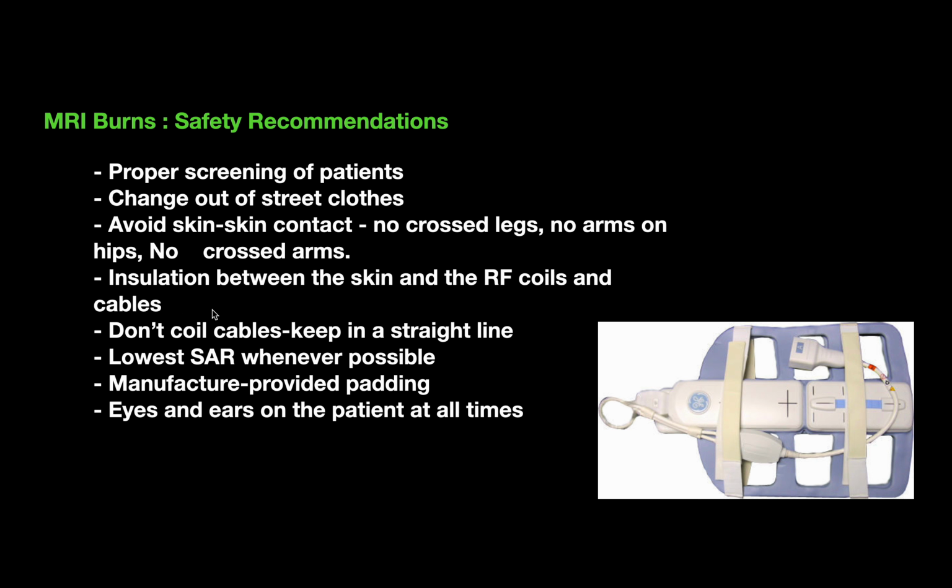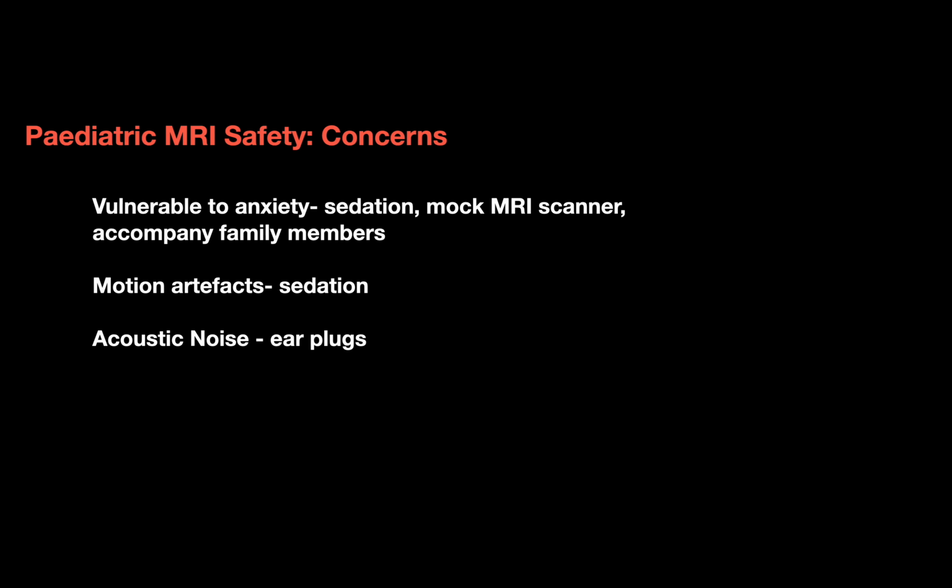Insulation between the skin and the radio frequency coil and cable should be there. Don't coil the cables. Keep them in a straight line. It's better to keep the specific absorption rate lower whenever possible. Manufacturer-provided padding should be there. Eyes and ears on the patient at all times. So these are the safety recommendations for the burn.